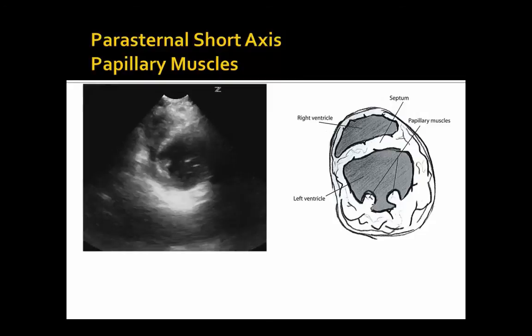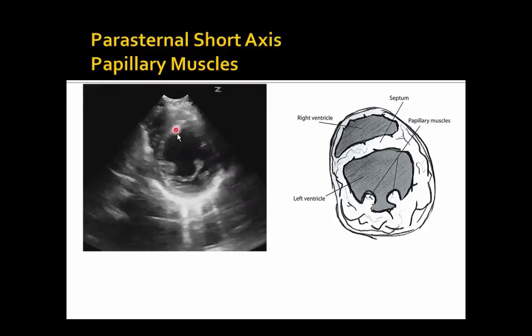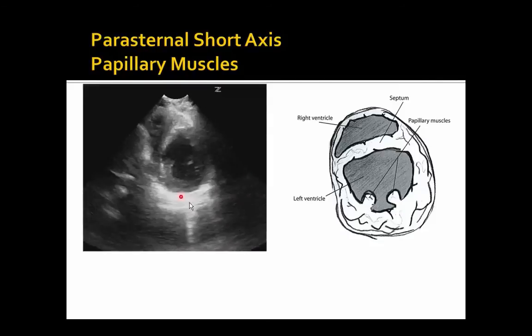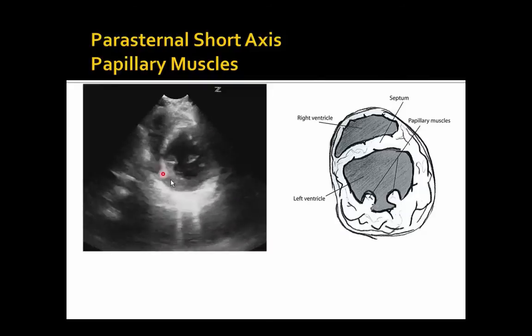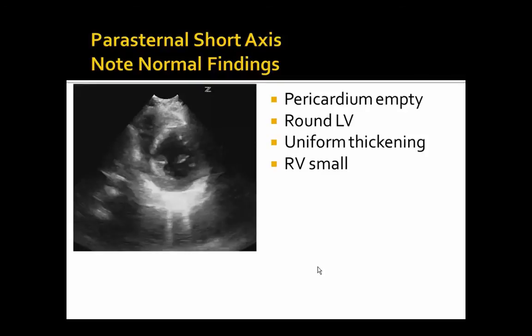And now we're again moving away from the sternum to about the mid portion of the left ventricle, and we can see it looks nice and circular. We see papillary muscles here now. Bright white pericardium wraps around, right heart structures here, and we can take note of pretty symmetric thickening, pretty good volume change going on in this left ventricle.